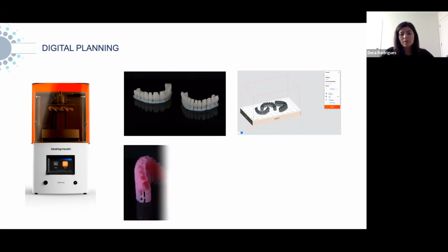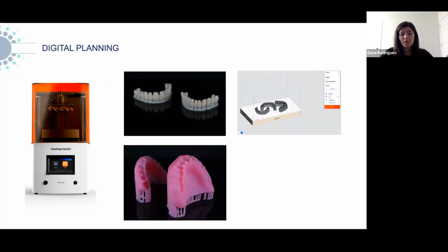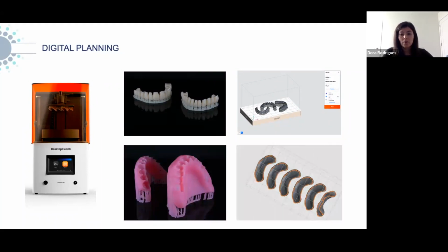And then I print my base. And one feature that I love about the Einstein is this autopilot feature that orients my base in a way that the supports are not on the intaglio and are not in the sockets. It takes longer to print. So if I'm in a rush, I wouldn't print it this way. But because I have time, at least I can print it the day before the surgery.